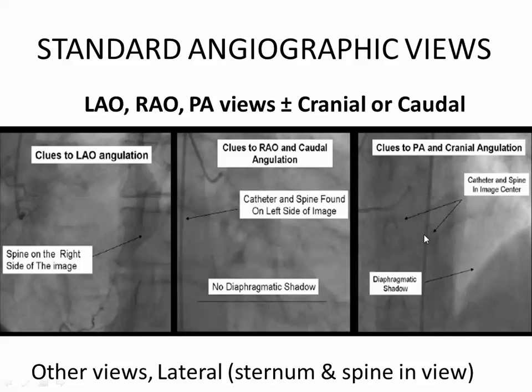This is the shaft in the middle. Okay? And the spine in the middle. If the camera is imaging me, okay, left LA, imaging me, okay? Where is my aorta? Here. Fine. And the shaft, the catheter here. So it's what? This AP, anteroposterior. It's not RAO or LAO.